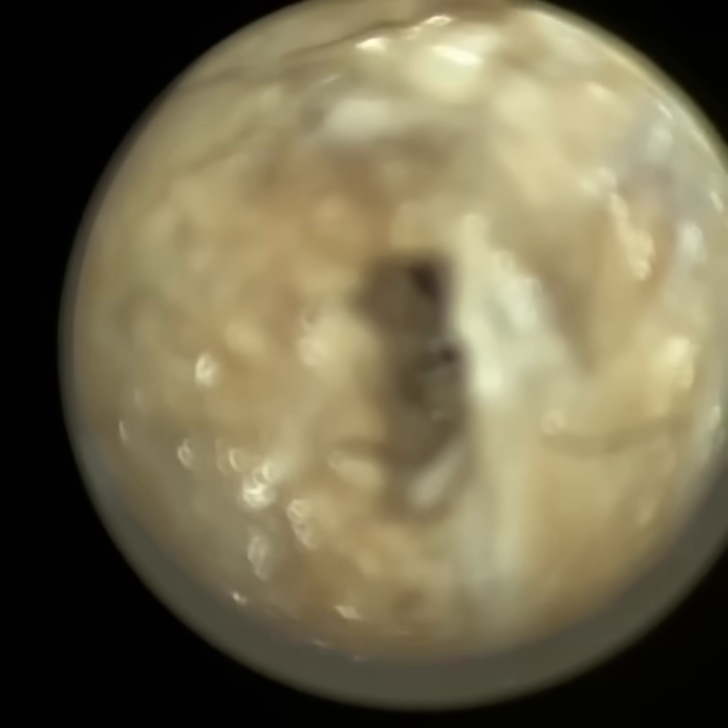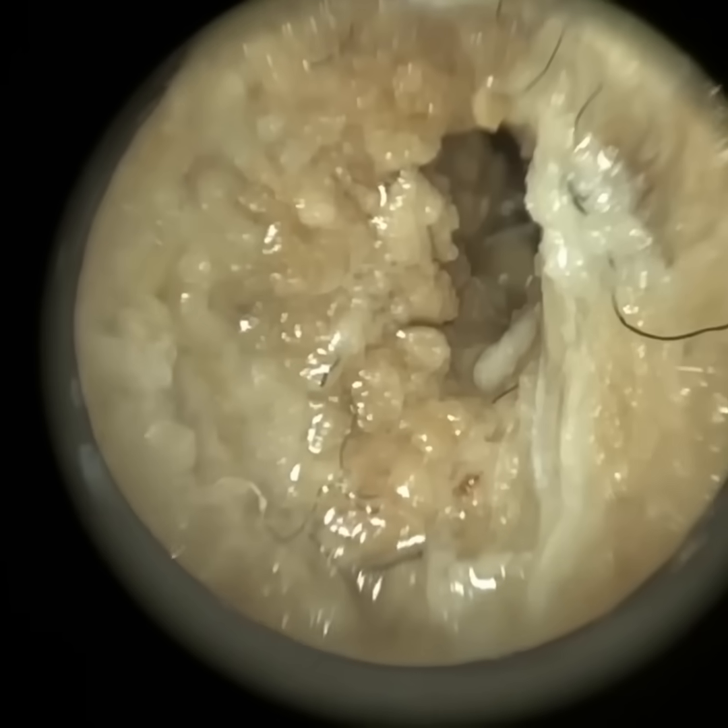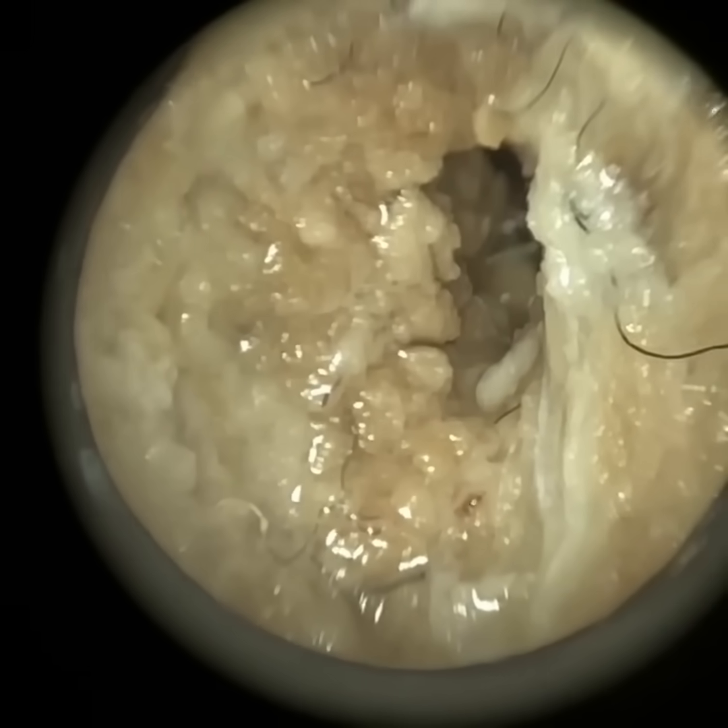Hi everyone, this is Neil Reiteter, consultant audiologist and director of Clearwax. Thank you for joining me in my latest video using the Waxscope.